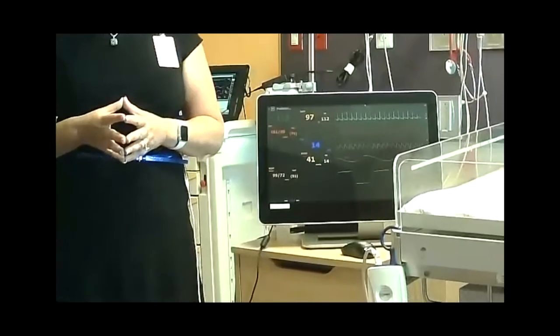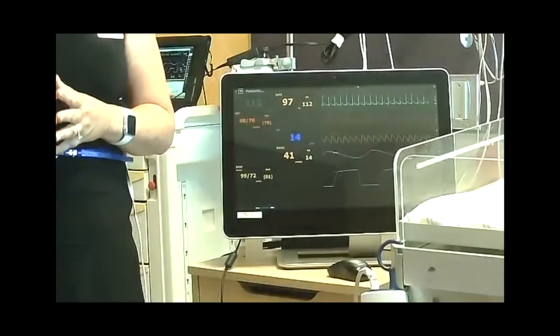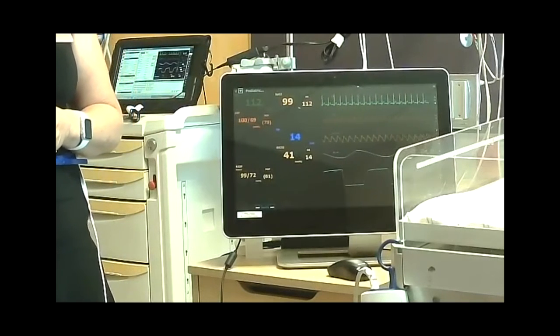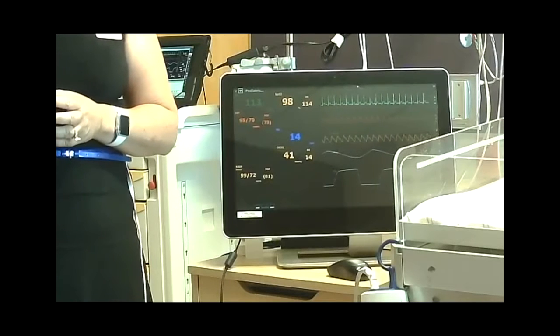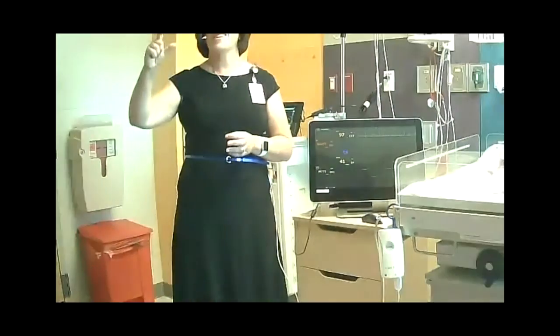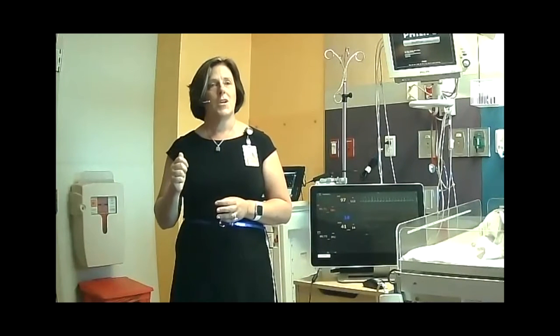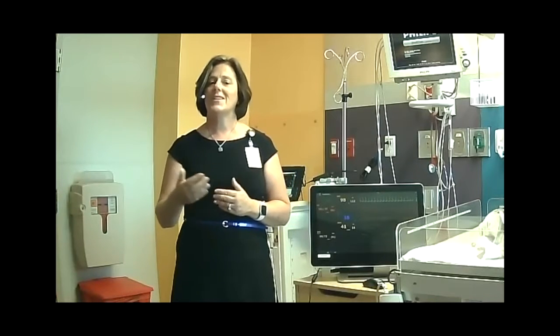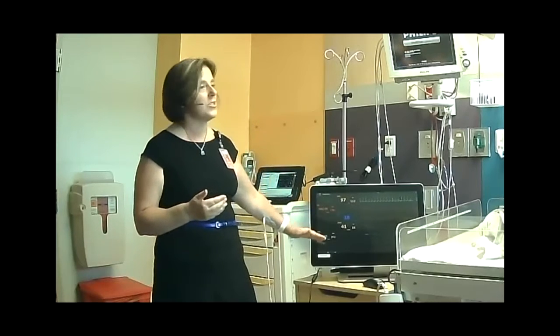I do encourage you not to stare at it continuously and not to always get caught up in the exact moment of what's going on. Yes, it will alarm at times. It alarms because we set limits to let us know. Sometimes it might bounce a limit, it lets us know, but then everything got better. The nurse actually gets a notification on the voice box she's wearing, the Vocera. It'll click saying something went off. Are you okay? And the nurse can look and say, yes, I'm okay. If she has a second patient, she can also pull up and watch those numbers in the other room. So she can watch both patients at once, even when she's not physically there.